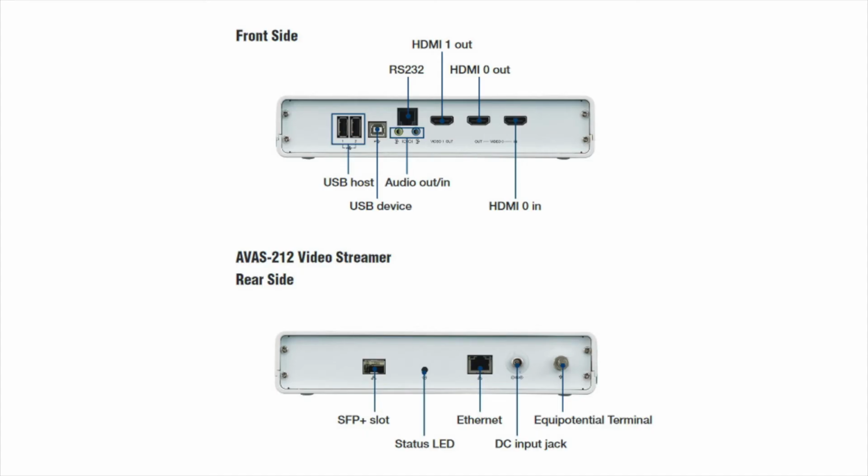Using encoders and decoders on the fibre optic network lets us maintain the highest possible quality within the OR and also affords us the opportunity to modify the content for transmission across the wider network, such as the Trust's LAN. This can be used to feed training rooms and remote observation suites.